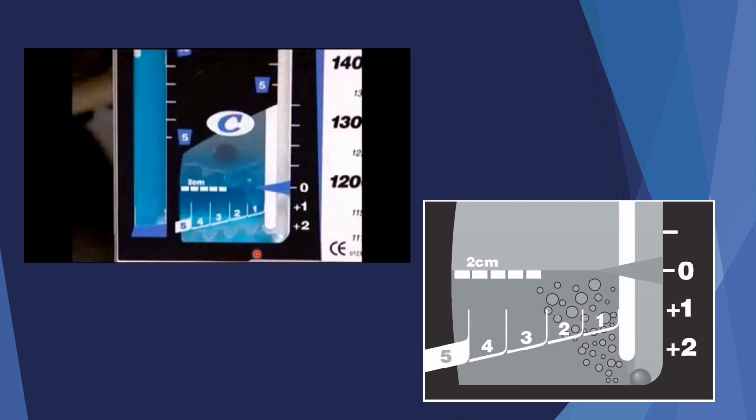You never want to leave that chest tube clamp on for more than 1 minute or so, because again, you're creating higher pressure and defeating the purpose of having that chest tube in. If you had a pneumo, it can re-expand within a few minutes if you leave a chest tube clamp on.